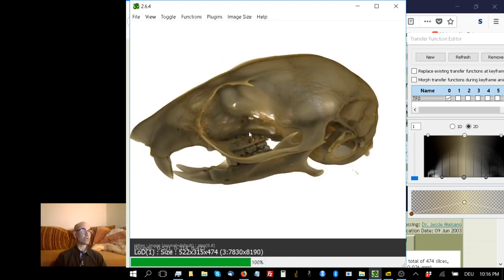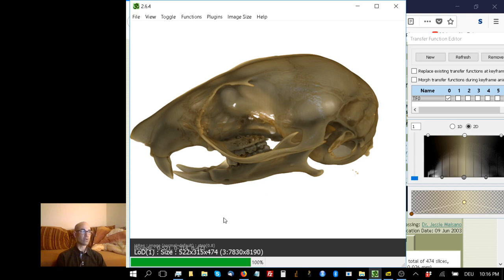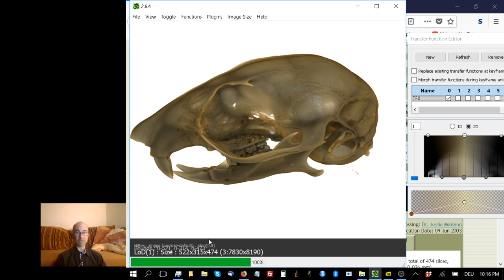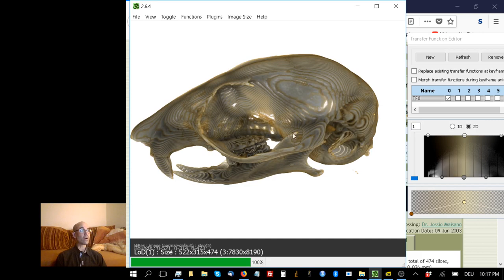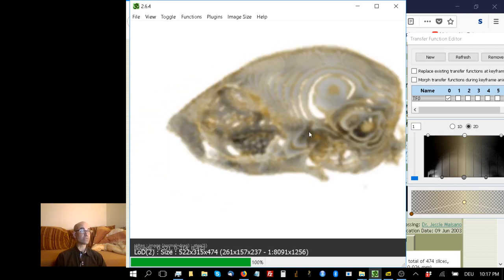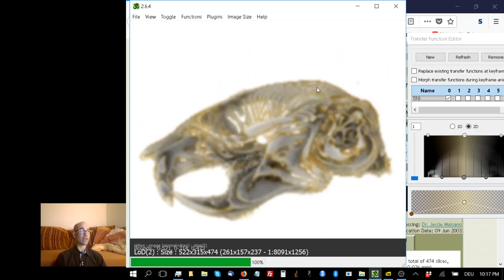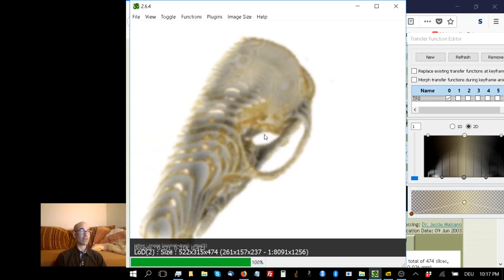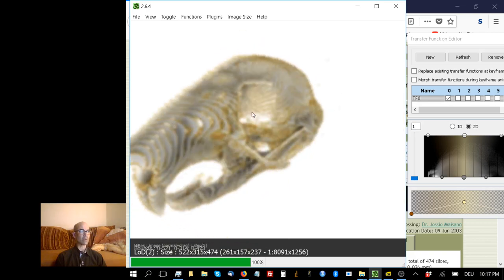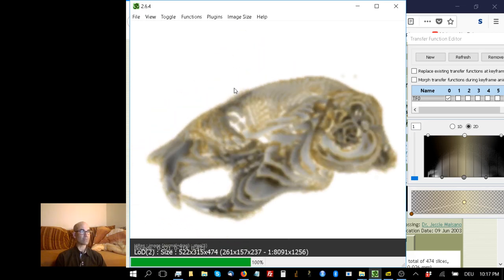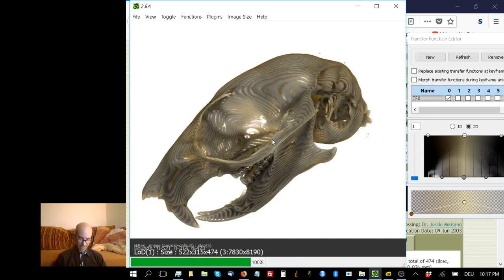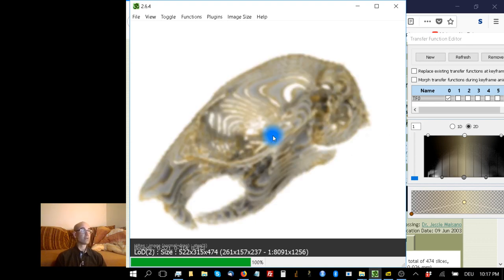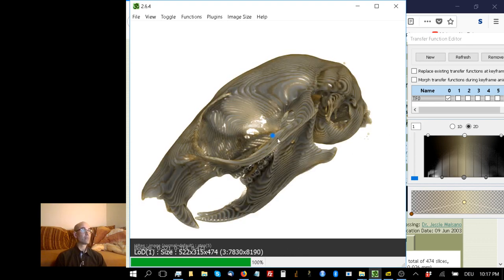You can change the quality of this reconstruction, which is a double-edged sword. The higher the quality in high-res mode, or the lower the step size, the more computer processor intensive it is. If I hit page down, that step size is moving up and the quality goes down, but it's more responsive. There's less delay after I rotate it with the left mouse button.